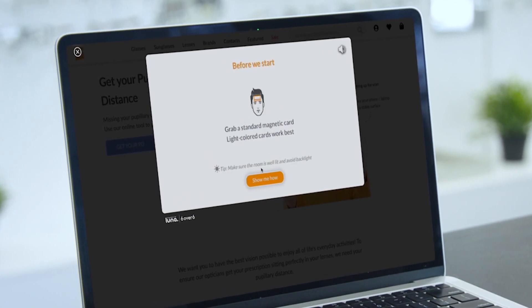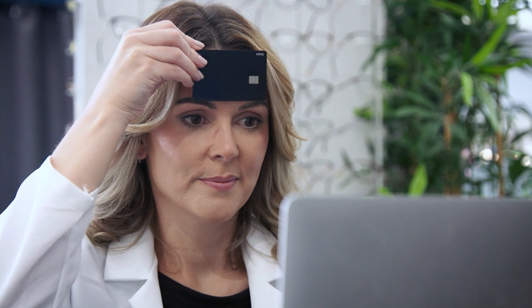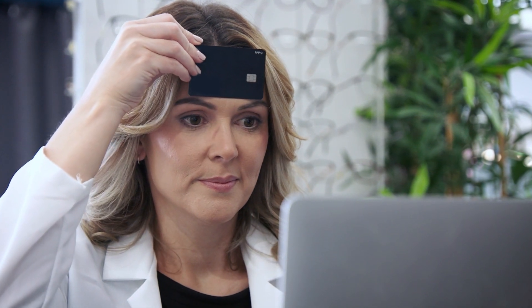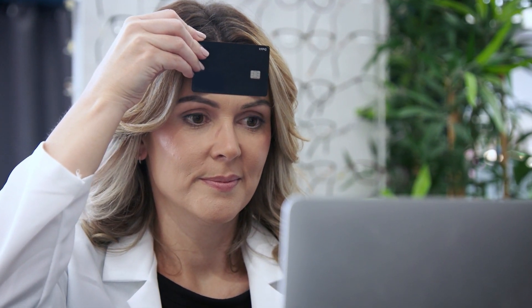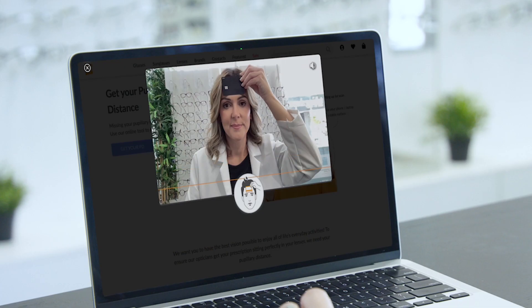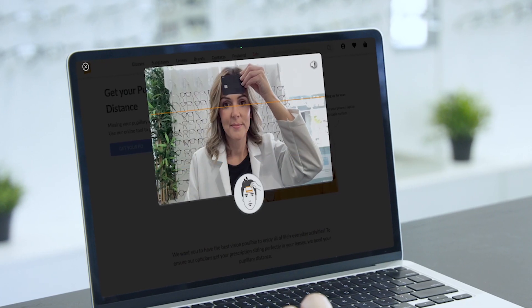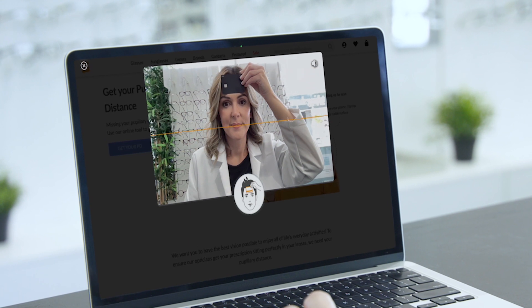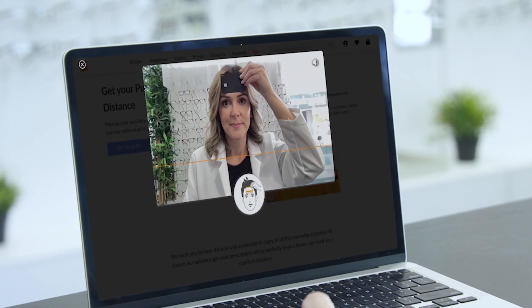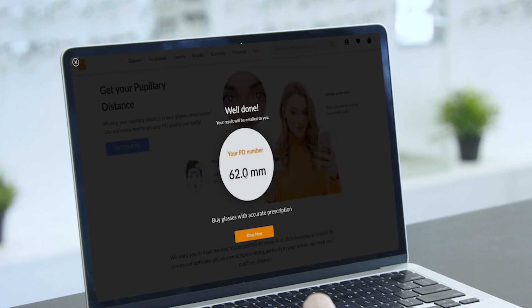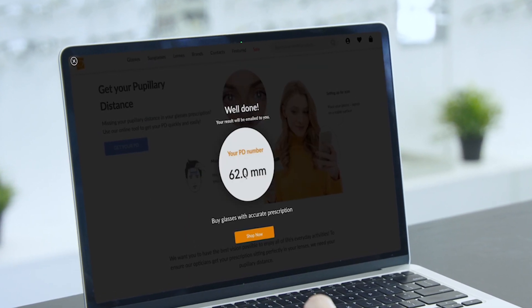Listen to the voice instructions, then grab any card with a magnetic strip. Take off your glasses and look directly into the camera. Once your scan is complete, your PD will appear on the screen — don't forget to write it down so that you have it on hand.